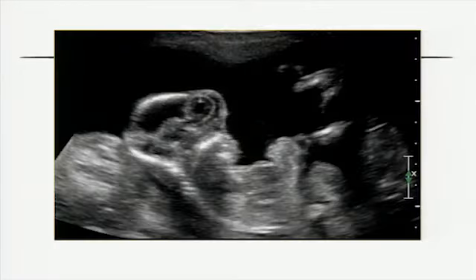And our images are looking at the head, top of the head, a little bit of the area of the palate and the mandible, looking back to the spine, to the little tush. And this is what they were calling the gastroschisis. The cord did insert into the defect. It did not insert normally into the abdominal wall.